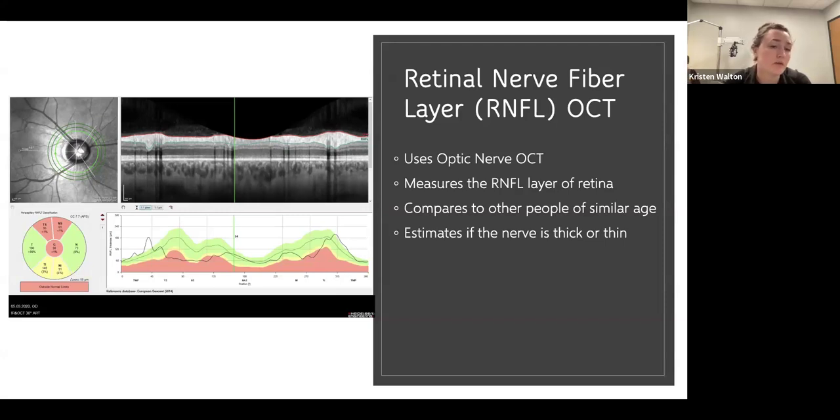Colors are great. They can be helpful, not necessarily an indicator of good or bad. So that's something that can be deceiving. We can actually have disease if patients are in the green, and that's why comparison over time can be very, very helpful.